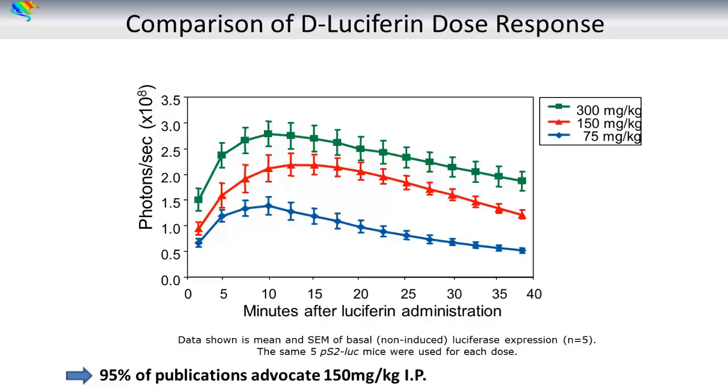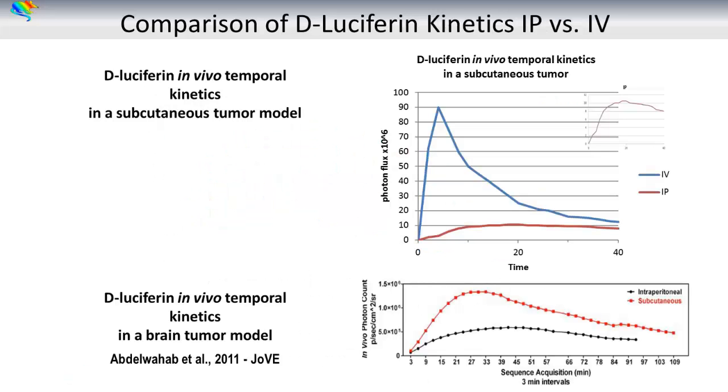The rule of thumb is to stick with the same dose and same route of delivery within a study. I also like to stick with the same batch of D-luciferin. Keep D-luciferin on ice under foil and toss at the end of the day. Comparison of D-luciferin kinetics IP versus IV.